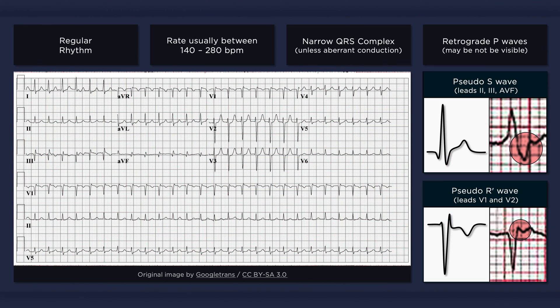Unfortunately, many ECGs of AVNRT do not reveal either pseudo-S or R prime waves. In this ECG of AVNRT, the P wave is buried behind the QRS complex in lead II. The P wave is visible in lead V1, however, in the form of a pseudo-R prime wave. Other less common and atypical forms of AVNRT also exist in which the P waves can occur before the QRS complex. The ECG may also reveal coinciding findings such as electrical alternans or diffuse ST depressions.